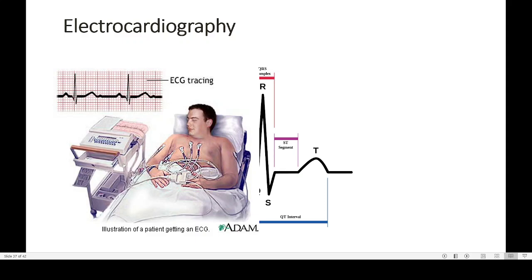So you might have heard about an amplifier in a sound system. What they will be doing, the mic is producing a current. That current will be amplified several times and fed into a speaker. So we are hearing a louder voice. The same thing happens here.